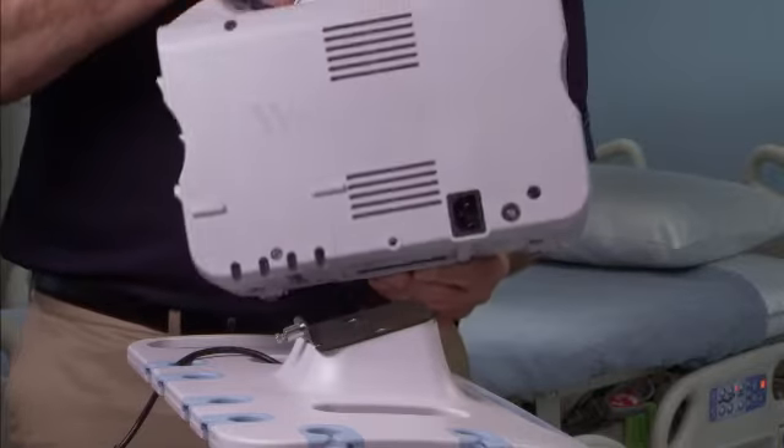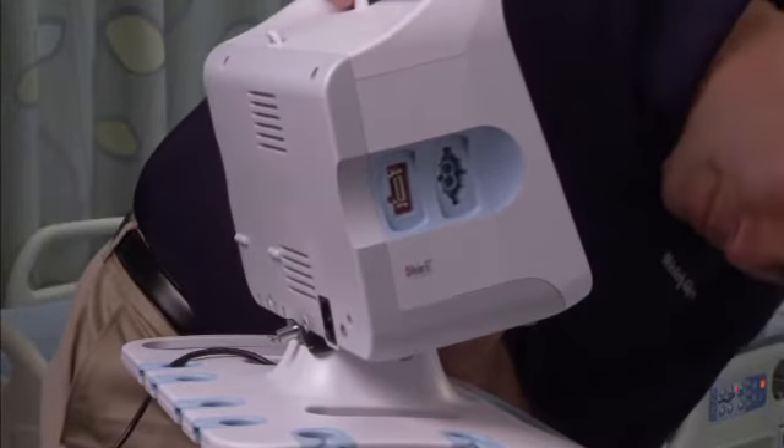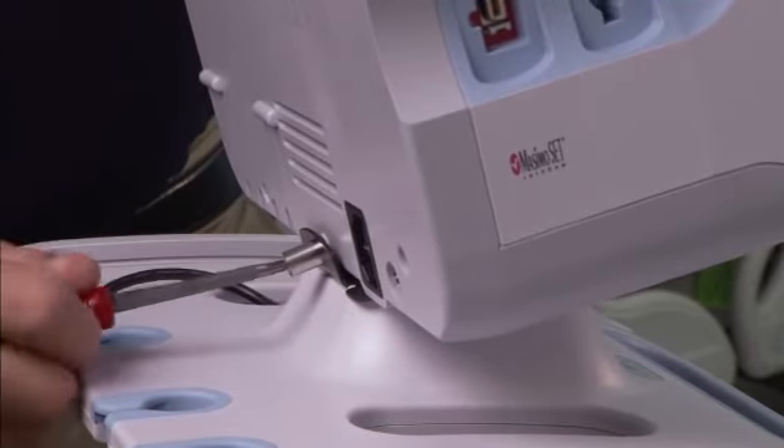To mount the monitor on a stand, align the monitor on the back plate in the center of the stand tray. Tighten the screw on the plate into the screw hole on the back of the monitor.